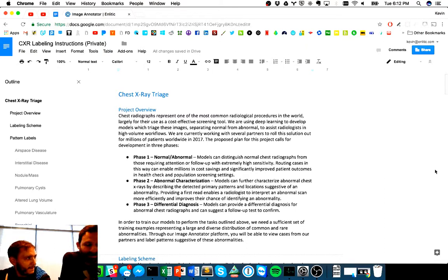So my name's Anthony Upton. I am the radiologist advisor to Enlitic, and I'm responsible for creating the labeling system that you're about to use to assist us with achieving the goals that Kevin's just outlined. So the next part of the video, we're going to talk about some of the important instructions to assist you with actually using the labeling tool.